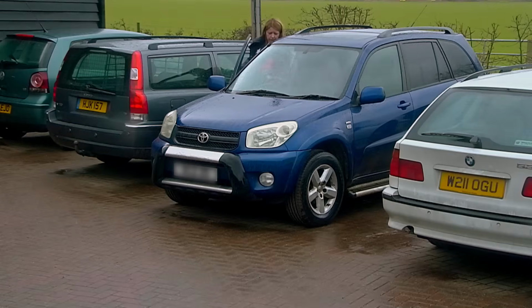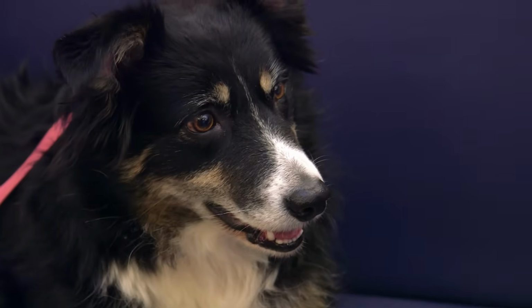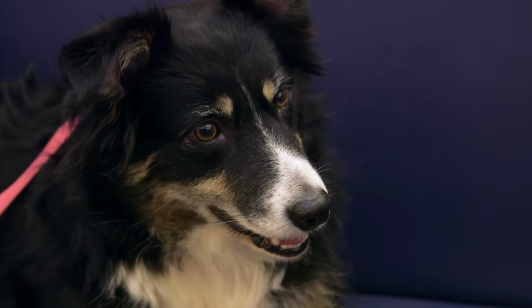If Lisa decides to go ahead, Izzy will be the first clinical patient to receive this brand new treatment from Noel. We've used stem cells before. We've used honeycomb metal. But what we've never done is make a bespoke, custom-built, 3-dimensionally designed metallic scaffold into which we seed the patient's own stem cells to regrow a piece of bone which hasn't existed for a long, long time because it got infected. The possibilities for treatment with Izzy really do represent a revolution in orthopedics, not just for animals, but also for humans.